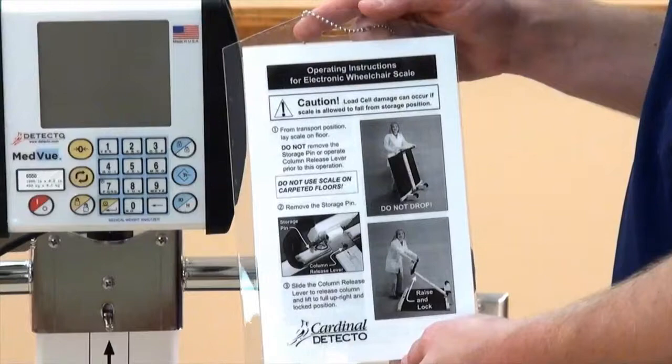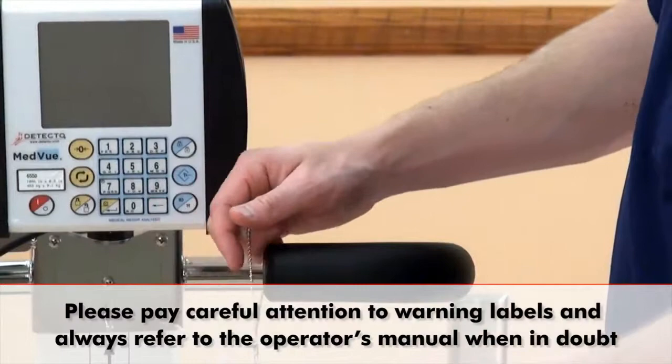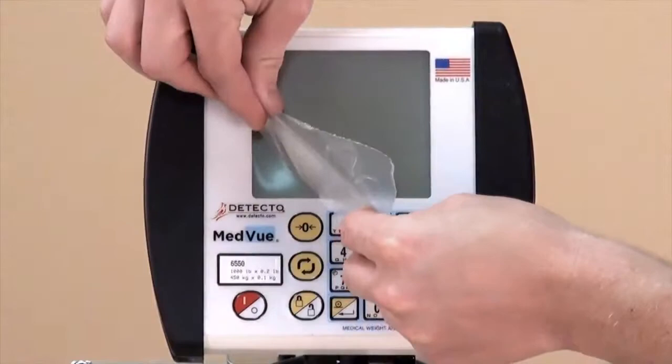Please note that when the column is in its upright position, a laminated card hangs from the handle for easy operator reference. Please pay careful attention to warning labels and always refer to the operator's manual when in doubt.